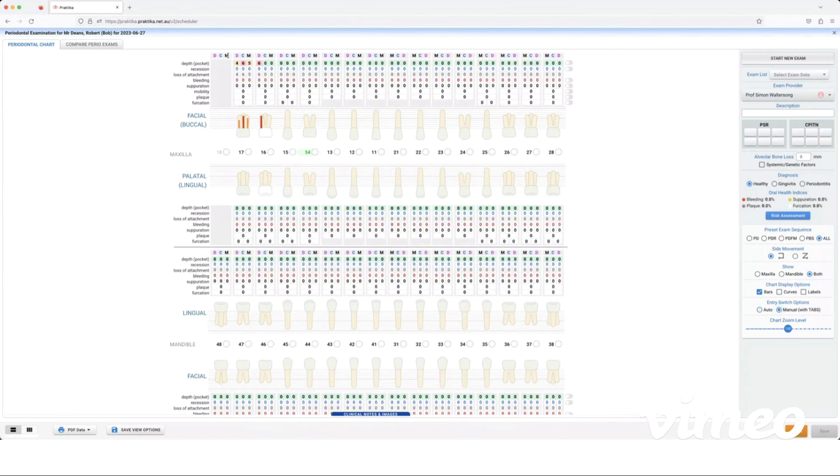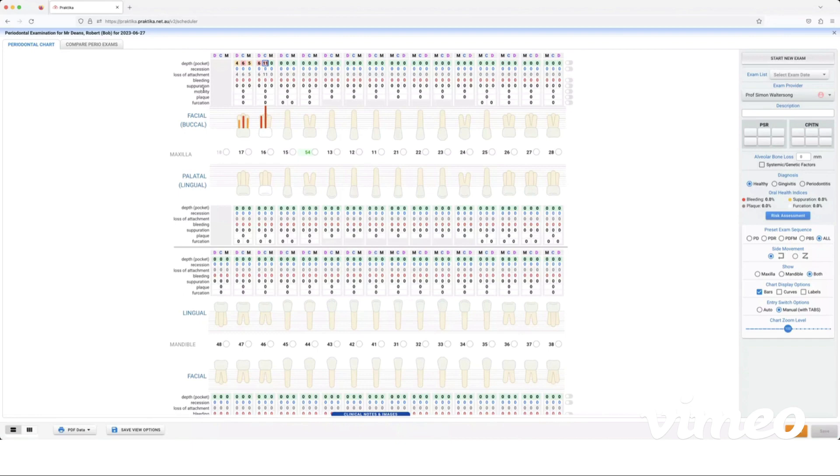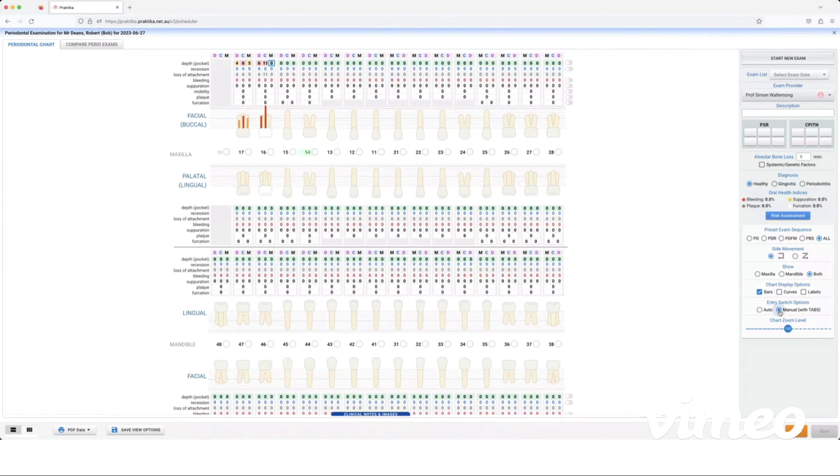That means that I can manually type in my number and it can be a double digit, so I can type 11. Now to get it to go to the next box I need to press tab. So if it's just a one-off that there's a tooth that has a pocket depth larger than just one digit, so if it's higher than nine, I can just turn it on to manual, type in my number, and then flick it back to auto and then it will go to automatic.